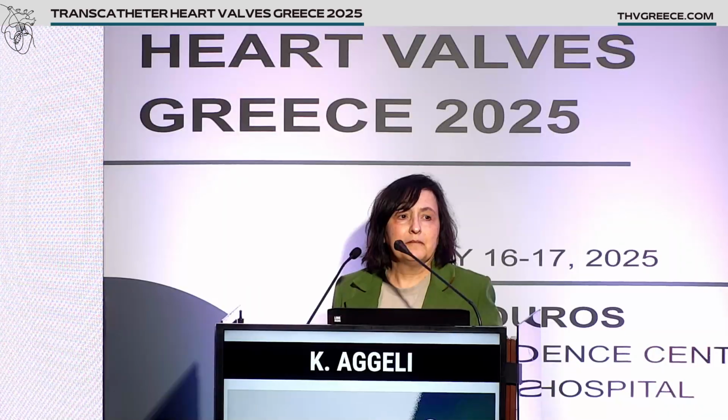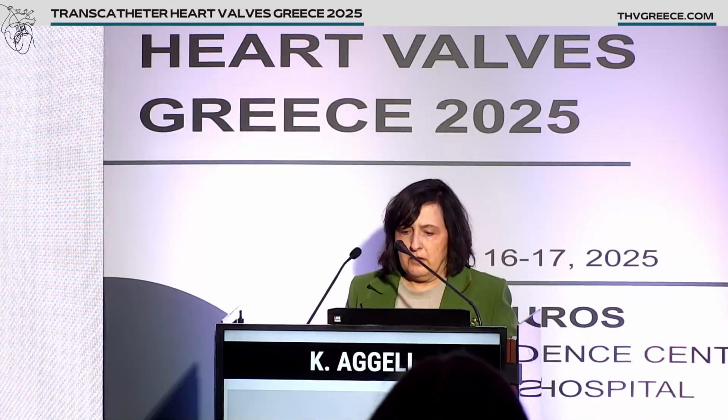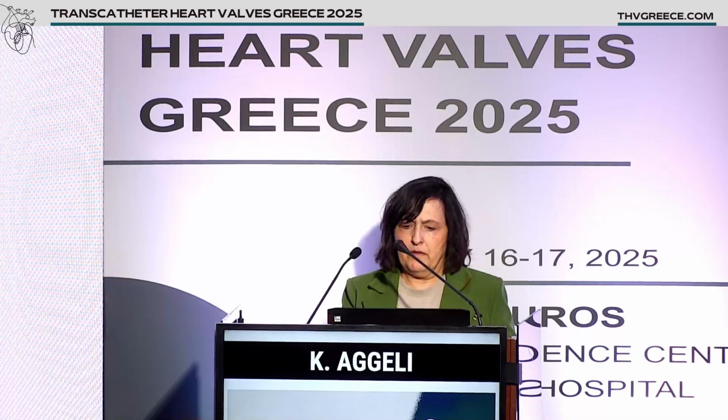Especially the right ventricular function, TAPSE, the others are important, but could you open that slide again? What's your opinion, the same question that Professor Sparger asked twice. It's very important for us to know which patients are suitable for TEER and which patients are suitable for transcatheter tricuspid valve replacement.